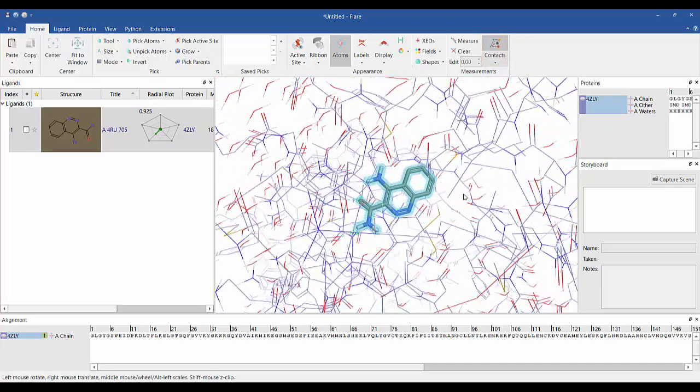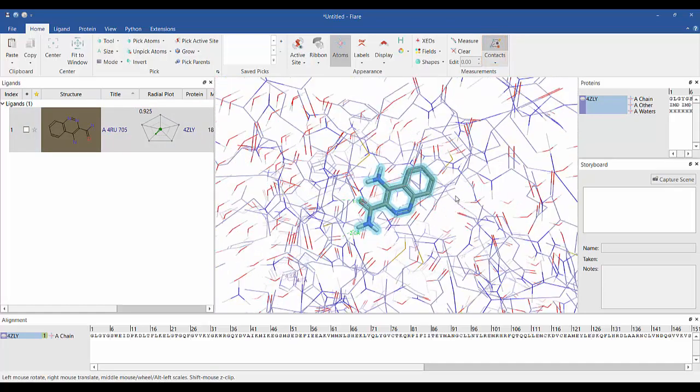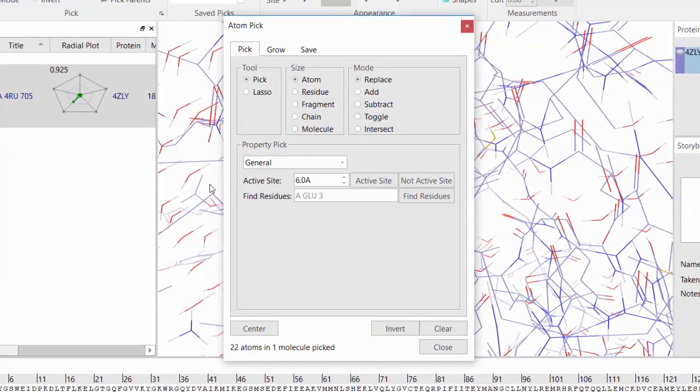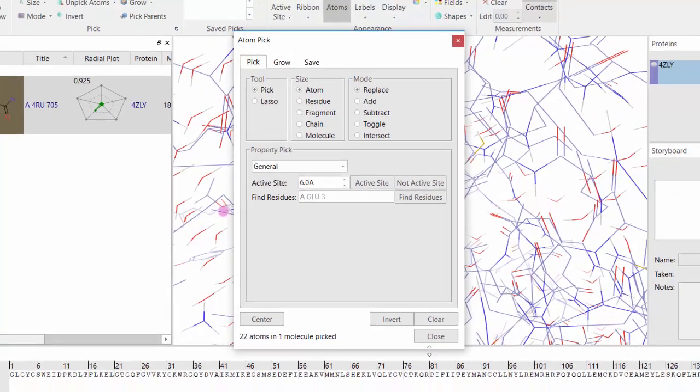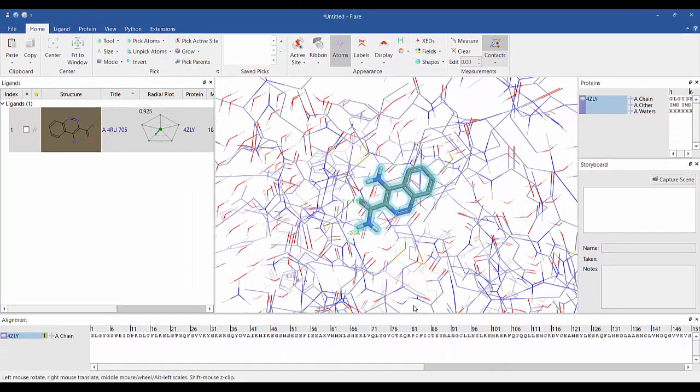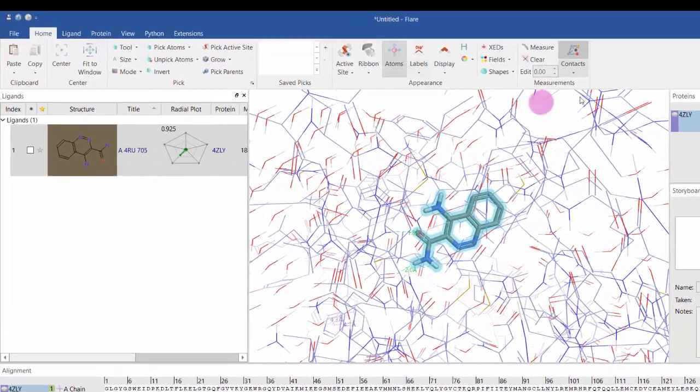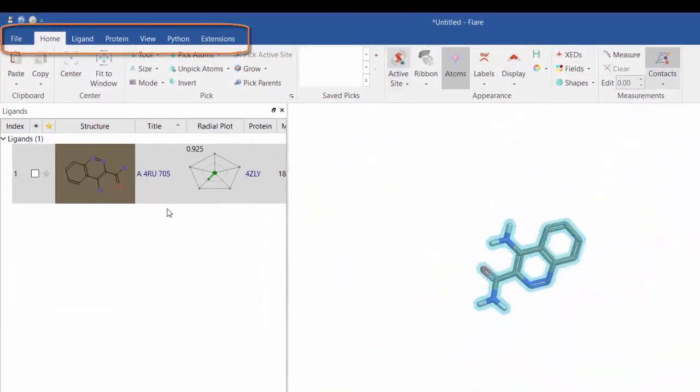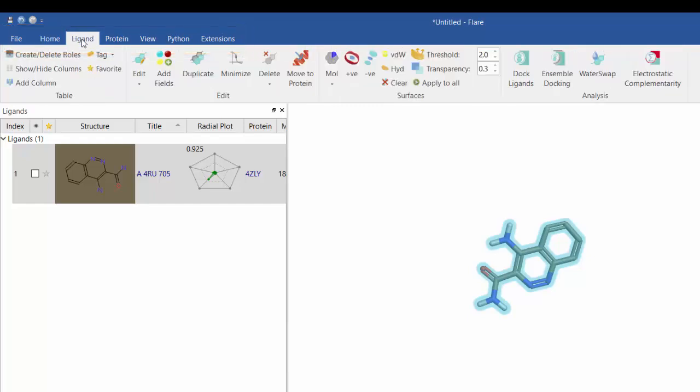The advanced picking feature ensures you have complete control over what is selected in the 3D view. The tabbed view in Flare logically groups relevant actions together, so for example, all actions available to ligand molecules are provided under the ligand tab.